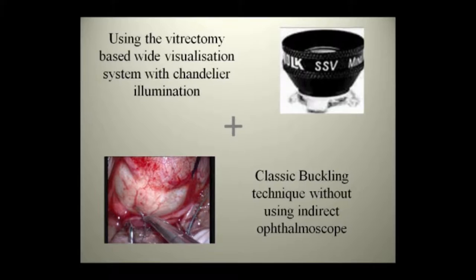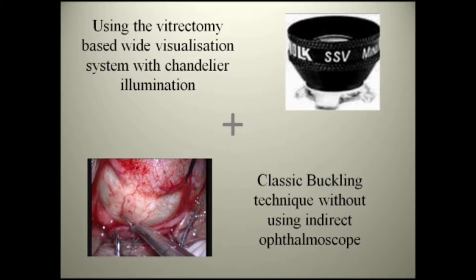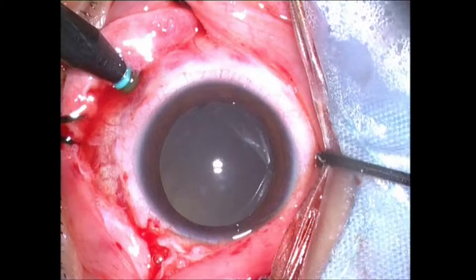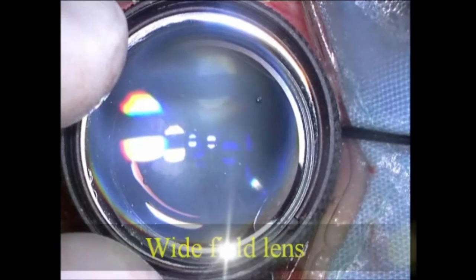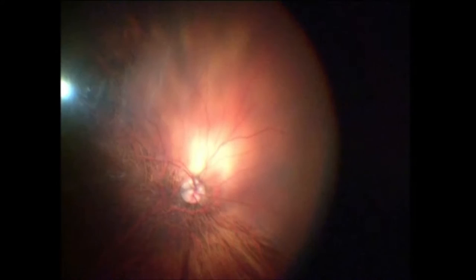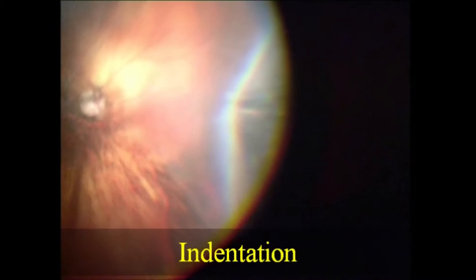We decided to combine the advantages of wide field visualization and chandelier illumination to perform classical buckling surgery without using indirect ophthalmoscopy. After tagging the muscles, the chandelier light is inserted in the inferior temporal quadrant and a self-retaining contact wide field lens is placed on the cornea. Once the fundus view appears, peripheral indentation can be carried out to locate the breaks and perform cryopexy to them.